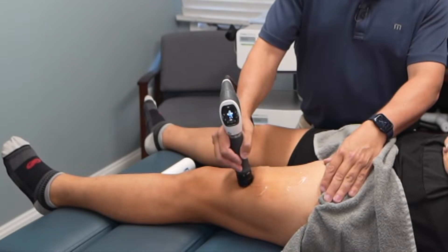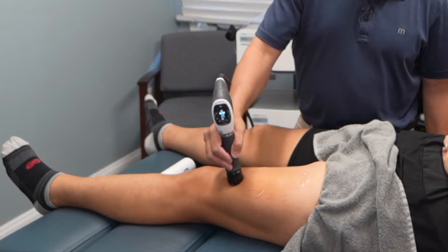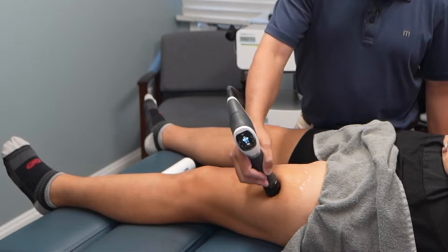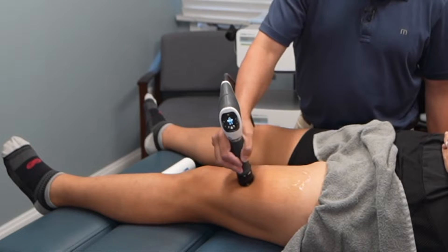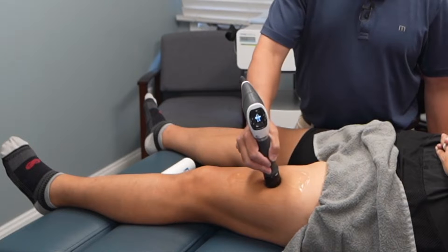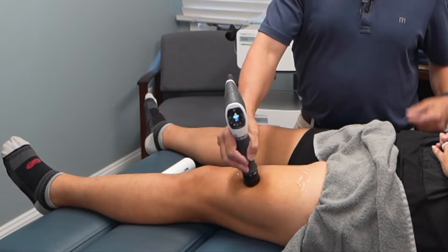What the patient feels is a deep ache in the treatment site. If there's a problem spot, you may feel more of a deeper ache in that area. As we loosen up that area, we'll move on to the next one. I'm scanning to see where her problem spots are — I've already palpated the area so I know where she's tight, and we're going to focus in on that spot. I'm going to do about 3,000 impulses into this whole quadricep, working the different portions of the quad, finding those tender spots. This is a great treatment because it treats a broader area, whereas the other one treats a more specific spot.